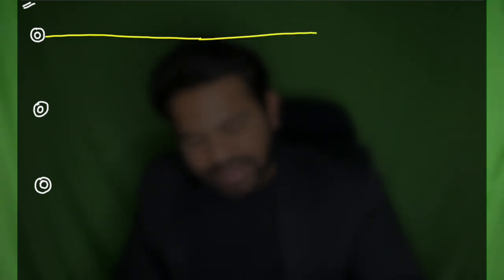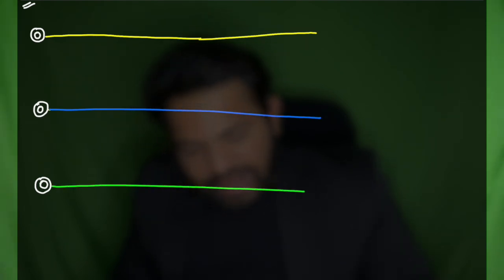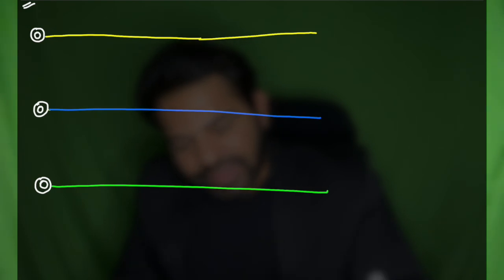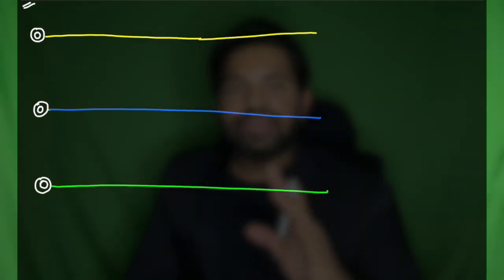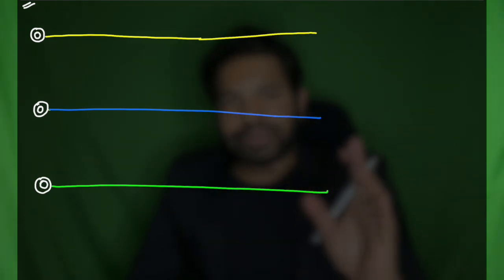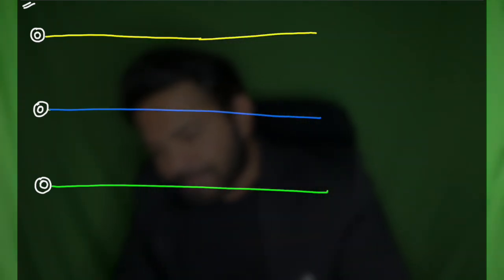This line represents the air. Then let's make a nitrous oxide line. Then let's make an oxygen line. Simple, this is very clear. This is an easy line diagram for knowing the high, intermediate and low pressure systems, so listen carefully.